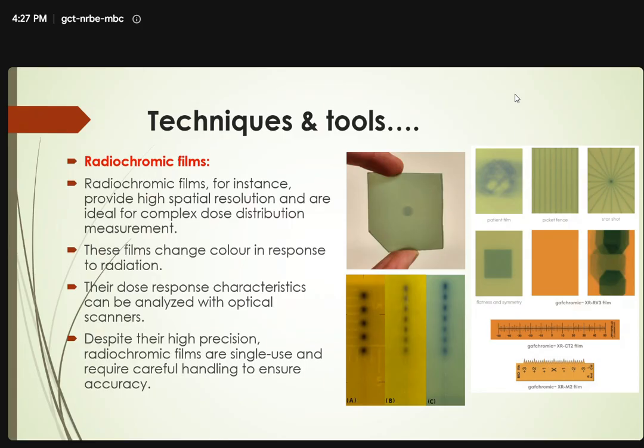This will give you the intensity profile after the processing.